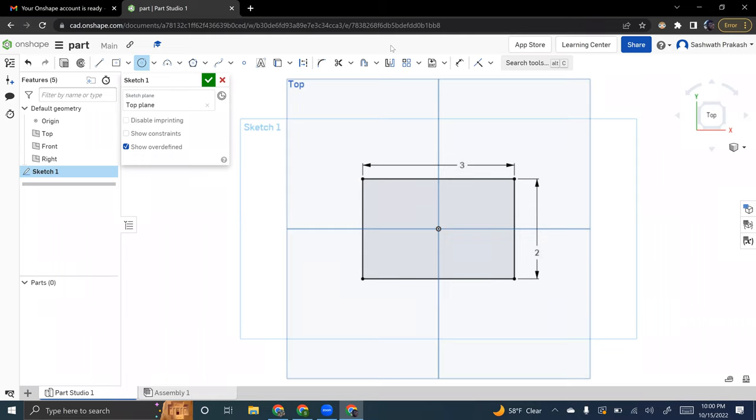Yeah, for sure. So right now I've just made the rectangle. So if you want to hide the front of the right view, scroll over. Yeah, you got it. Have you dimensioned it yet? You're right so far. And now to make a rectangle, yeah.